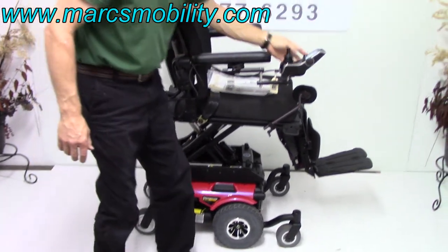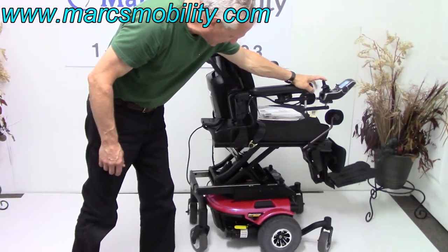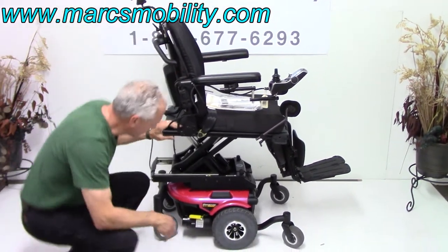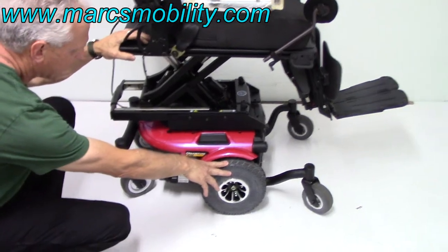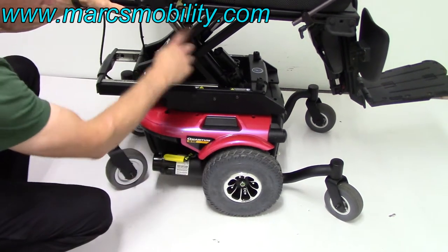This chair will still drive when the seat is elevated, but it will drive at a much slower speed. The base is a very well-built chair. We've got 10-inch solid tires, caster wheels in the front, caster wheels in the back. You've got a motor for each wheel, one on each side.